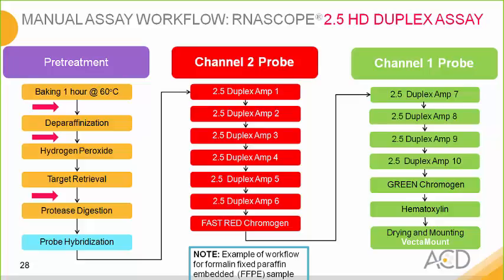The three arrows to the left show optional stopping points in the assay so that you can, again, complete this as a 2-day assay. But this highlights optional stop number 4, which is the best stopping point for the duplex assay. After probe hybridization, you would then stop in 5x SSC, leaving the slides at room temp overnight. This can be made by diluting any 20x SSC provided by any major lab supplier.